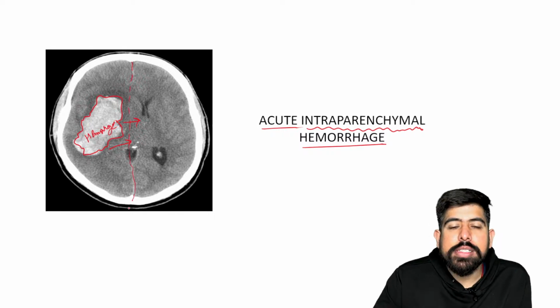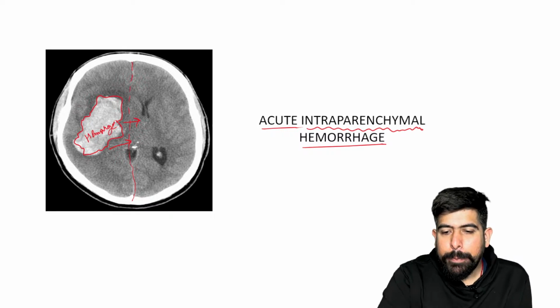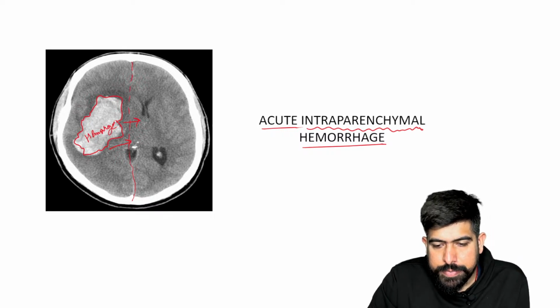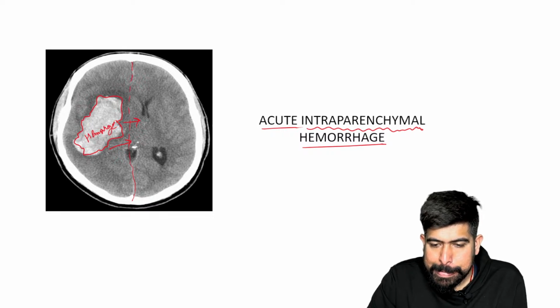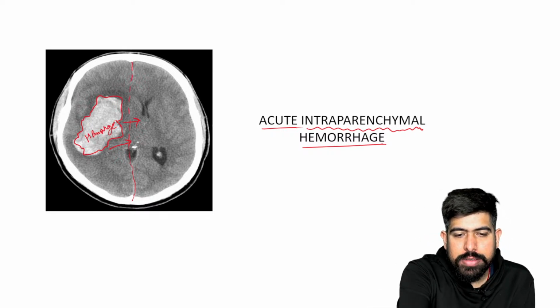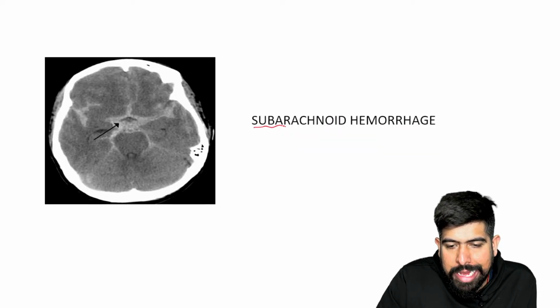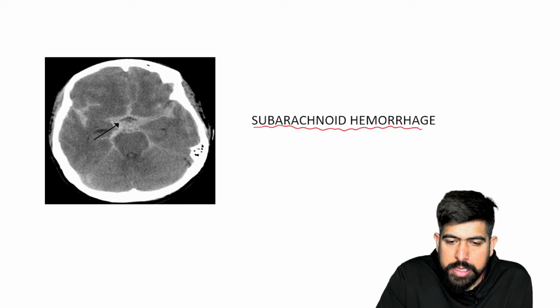This is the midline, and it is pushing away from the midline. Yes, very good. So this is about intraparenchymal hemorrhage. Next we have the subarachnoid hemorrhage.